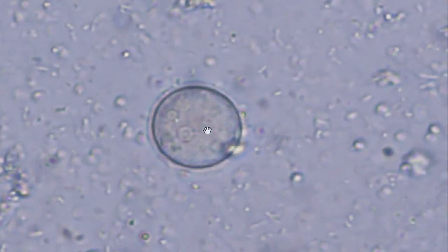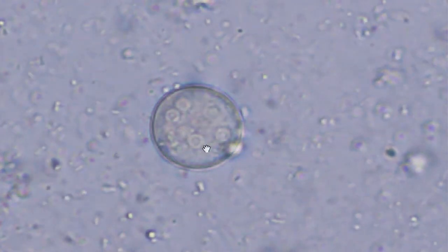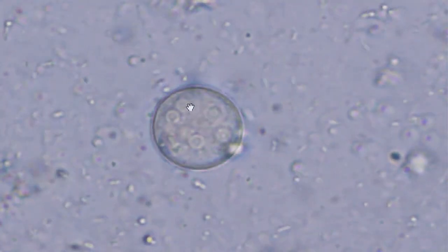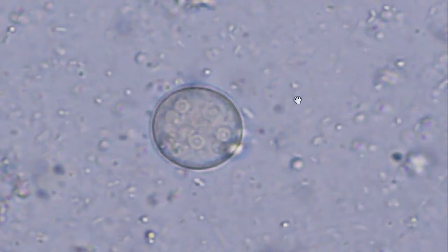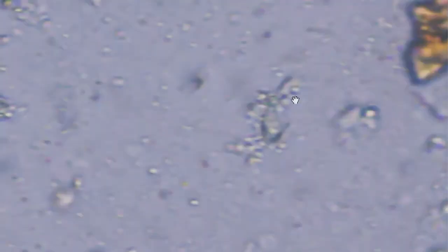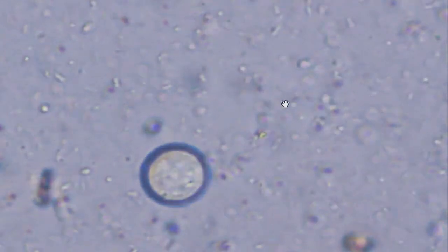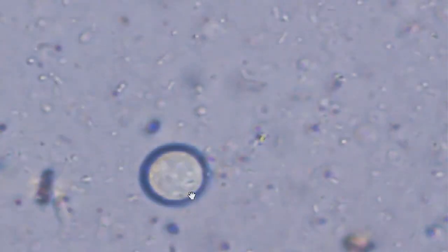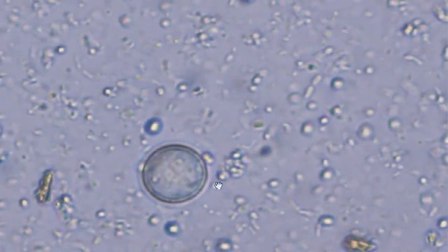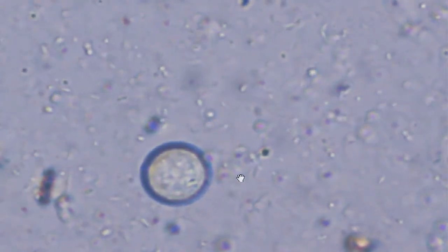It's difficult to see the morphology of the nuclei here. It's very hard to see that peripheral chromatin and whether the karyosome is central or eccentric, or if the peripheral chromatin is even. But because of the number of nuclei in that cyst, I'm happy that that's an Entamoeba coli. Now, I would not report only Entamoeba coli. I'd like to see more before I make my final report. So here's another one. As I move through the planes of focus, I see 1, 2, 3, 4, 5, 6, 7, 8 nuclei. So that's an Entamoeba coli again.